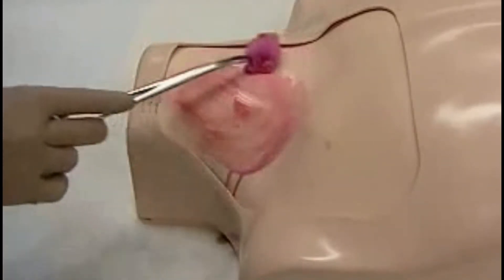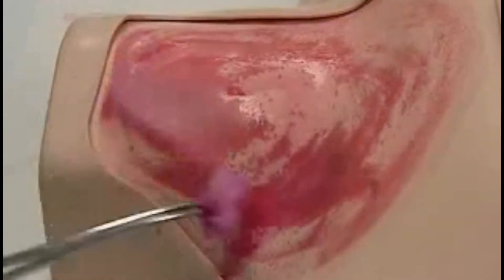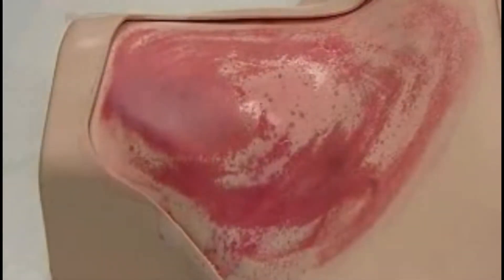We prepare the skin surface by wiping with antiseptic, circling outwards once, twice, and a third time. Our patient should be in Trendelenburg position with head turned slightly to the left, and we apply sterile drapes around the field.